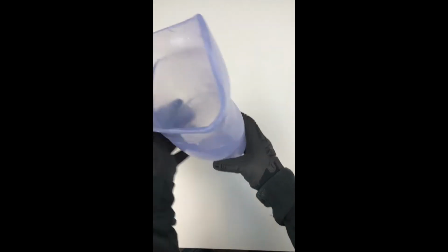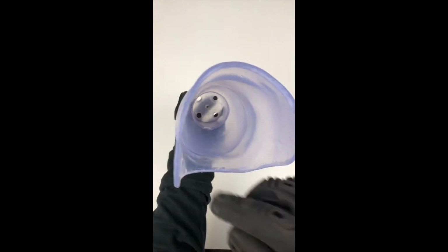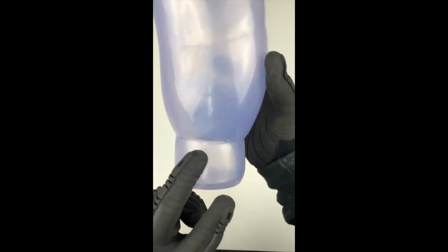Inspect the proximal aspect of your sealing area inside the socket. This area should be glass smooth with no imperfections or nylon marks. This will ensure you have an excellent socket seal.